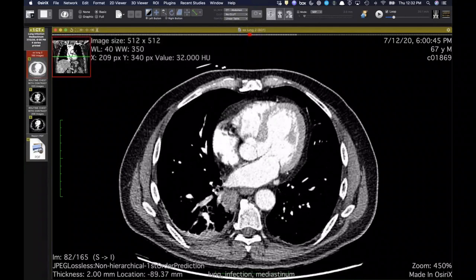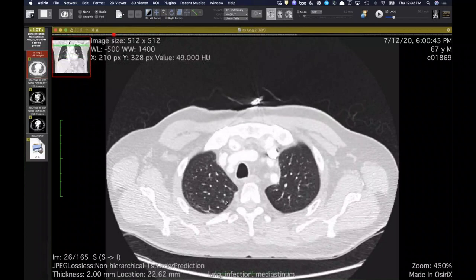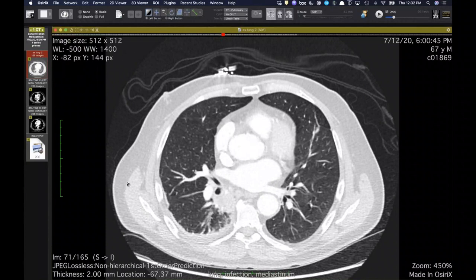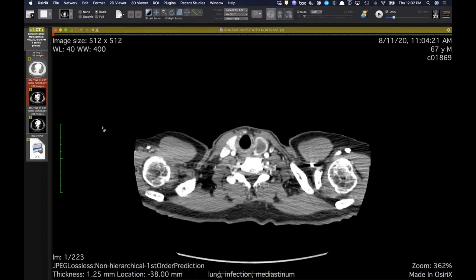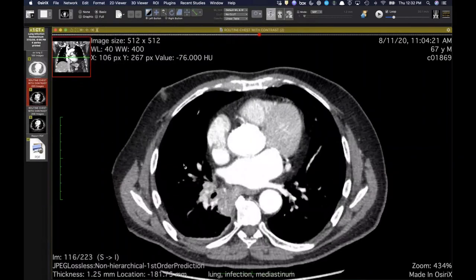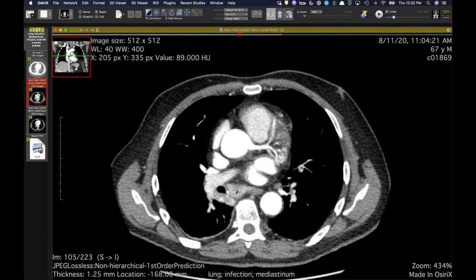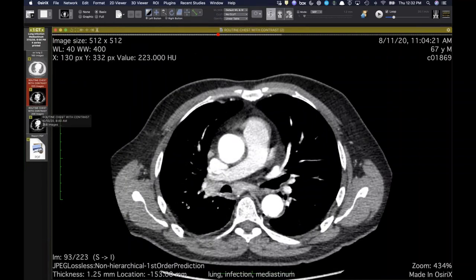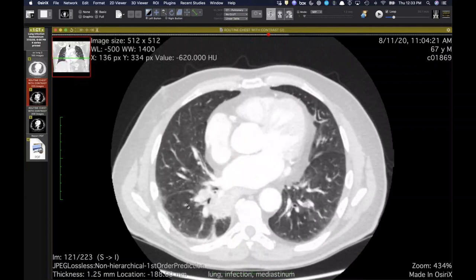It's not really exerting a lot of mass effect on the pulmonary veins. I know he has a history of smoking. He doesn't really have much in terms of emphysema. He was asymptomatic, so they were certainly worried about this being a cancer. I think he underwent a follow-up CT just prior to his bronchoscopic biopsy. And you can see that this area is enlarged. It does enhance some. And then the subcarinal node at this point is enlarged. And this was over the course of a month. So these findings prompted him to go to bronch.